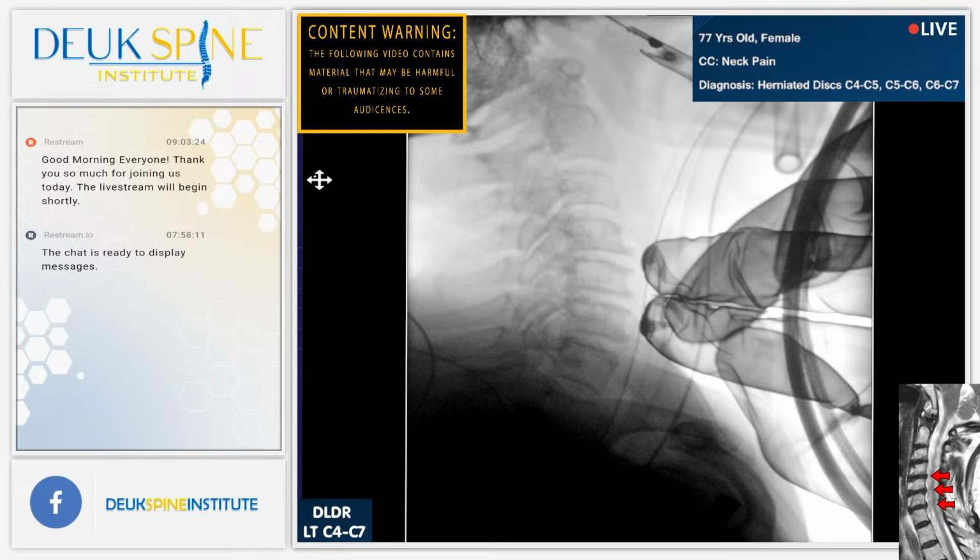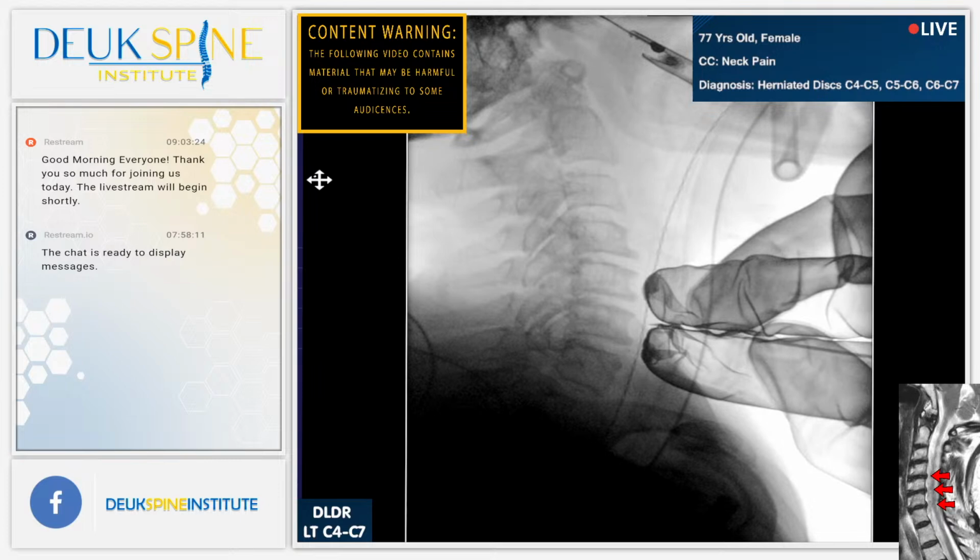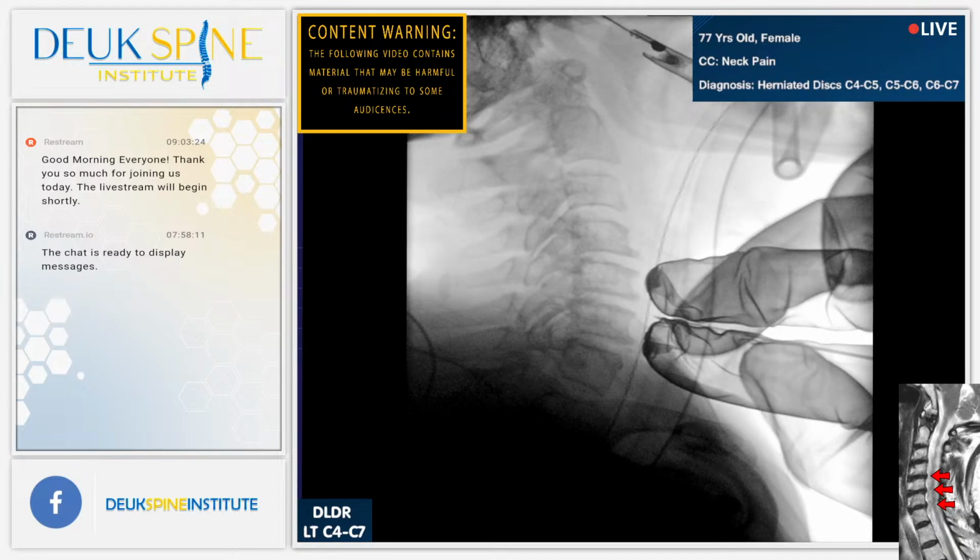So 2, 3, 4, 5, 6. So I was a little high there. Let's go down just a little bit. When I say high, I mean north or superior. Shot. That's a little too inferior, but I'd rather be a little inferior than superior. Shot. All right, so that looks pretty good right there. 2, 3, 4, 5, 6. You agree, Luis? Jordan? Shot.